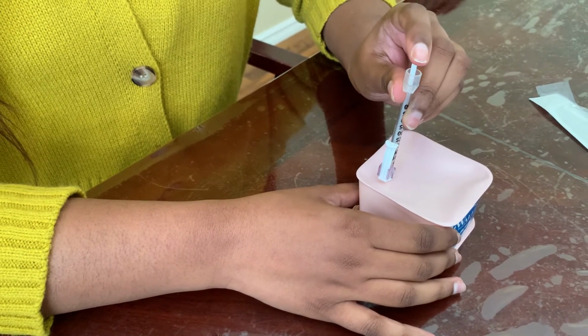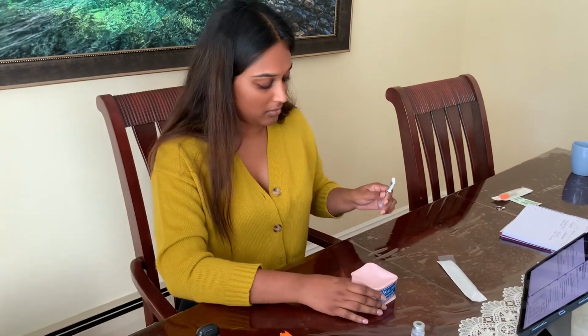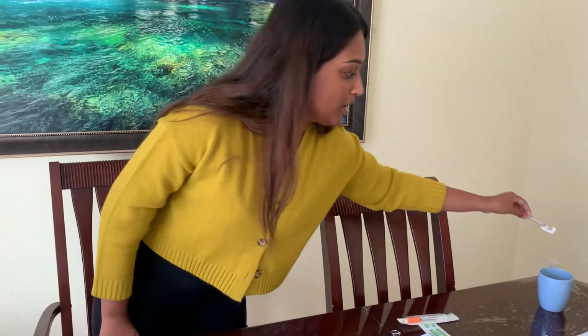I'm going to take this and inject at 90 degrees. Not going too fast. Okay, once that's done, I'm going to make sure that the safety procedure is on and that I throw it into my sharps container.